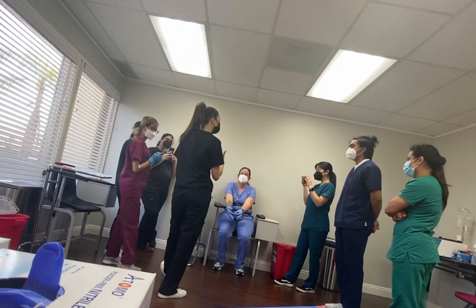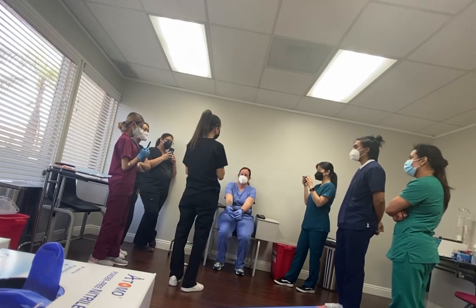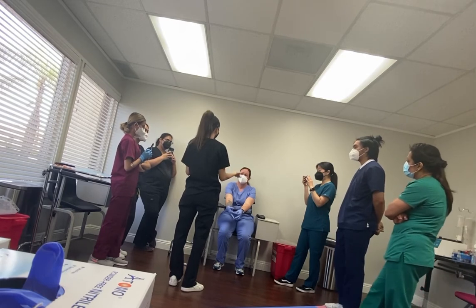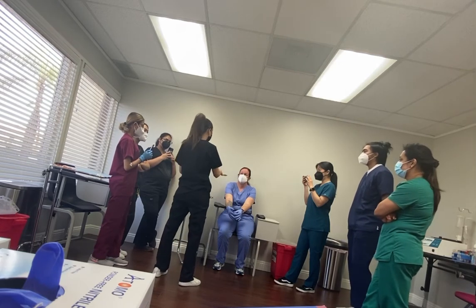As you walk in and your patient sits down, you say: 'Hi, my name is Kayla, I'm here to draw your blood. Can I get your first and last name?' They give it to you, then you get their date of birth.